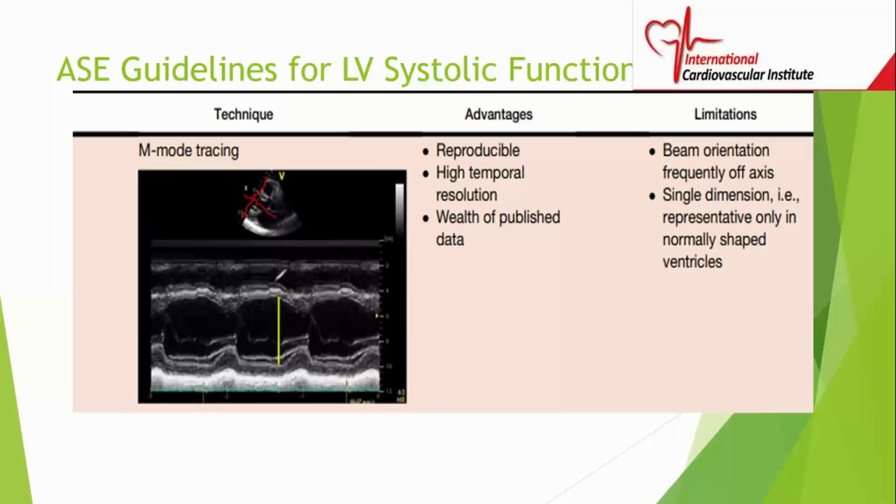So you measure the septum. Your measurement should be at the onset of the QRS, and for people doing the exam, you're definitely going to get that. This is the onset of the QRS right there. So the septal thickness from the top down to the bottom, septal thickness, LV cavity size in diastole. This yellow line represents that from the cavity to the tissue plane.